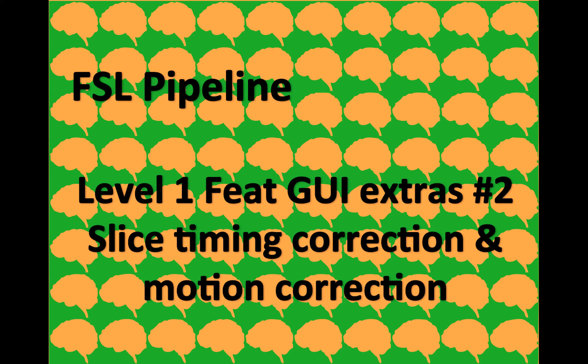We're moving on through the FSL pipeline and taking a pause to go through some of the options that can be set in the level 1 FEAT GUI which we've set up recently. This is the second video in the series — the last one talked about keeping your directories clean because of the practice FSL has of not overwriting a directory, but creating a new FEAT directory with a plus symbol.